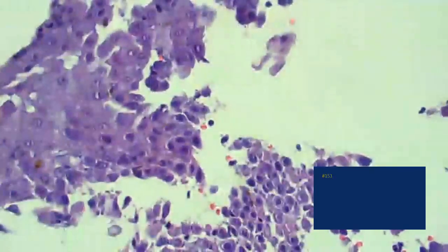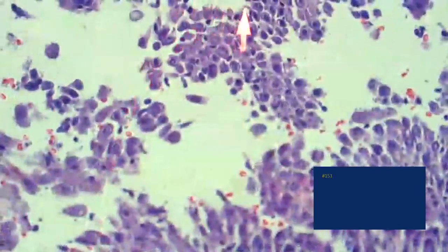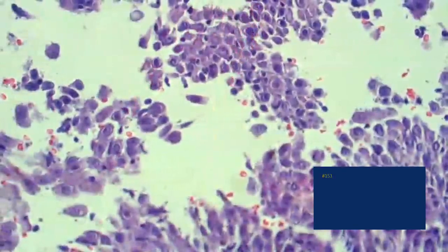The question is whether you get dyskeratosis, and you generally do not get very many dyskeratotic keratinocytes in Pemphigus itself. Sometimes in Hailey-Hailey, but notice that there really are very few dyskeratotic keratinocytes here. This is Pemphigus. Maybe one there, but not a lot.